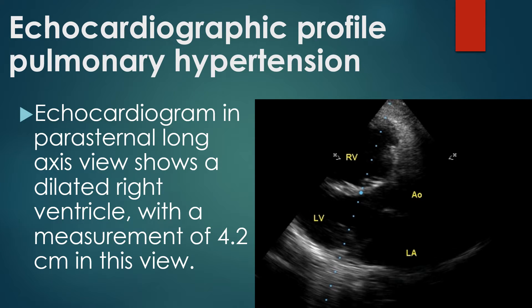Echocardiogram in parasternal long axis view shows a dilated right ventricle with a measurement of 4.2 cm. The right ventricle is hypertrophied and dilated due to severe pulmonary hypertension causing pressure overload. Normally, only a much smaller portion of the right ventricle is visible in this view. A better view to assess the right ventricle would be the apical 4-chamber view.